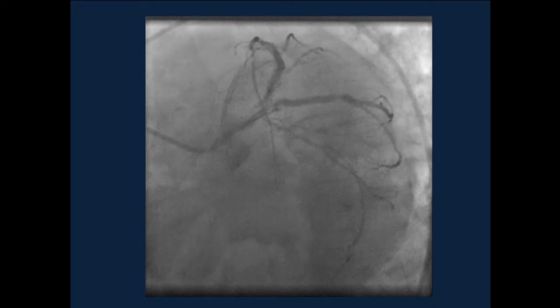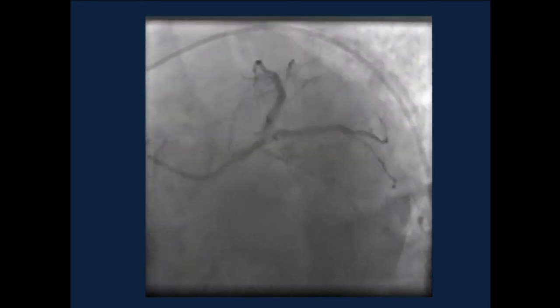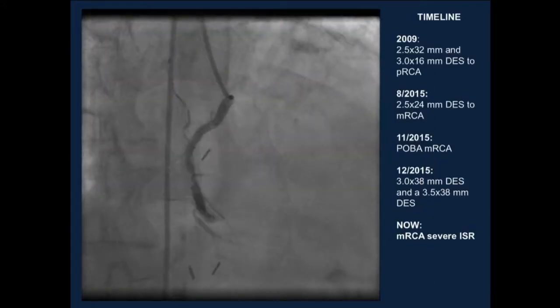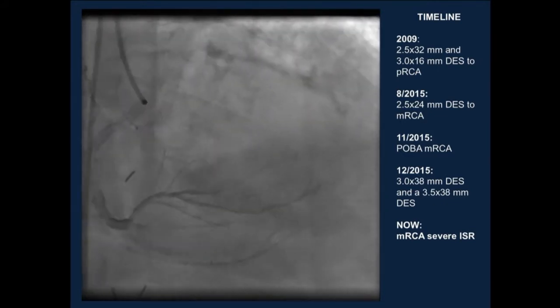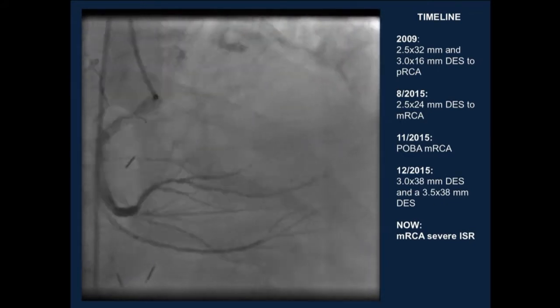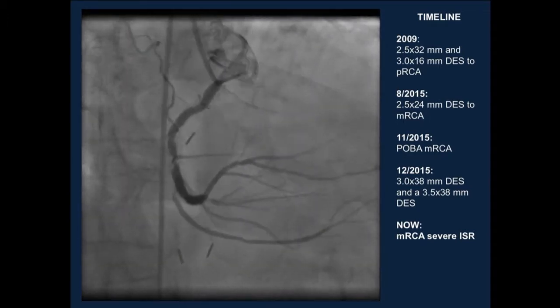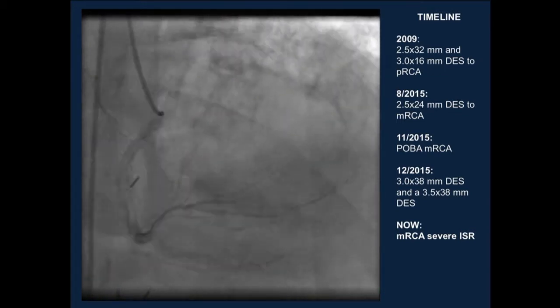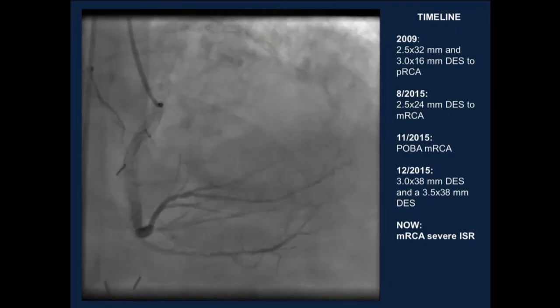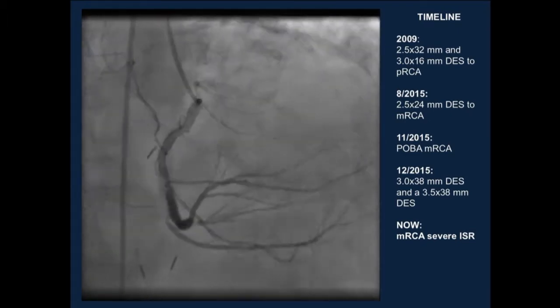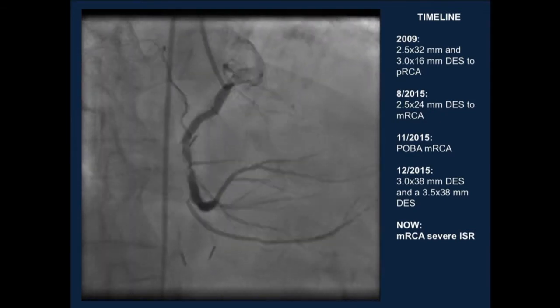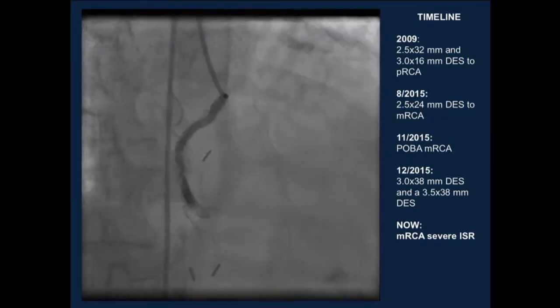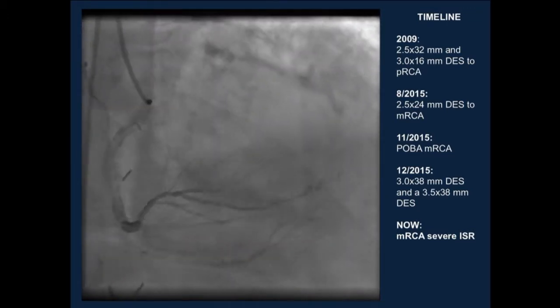Here are the pictures for the left system. As you can see, there is essentially severe proximal ostial LAD, ramus, circumflex, and some distal left main disease. There's the right coronary artery with a number of layers of stents dating back to 2009, when he had a drug-eluting stent to the proximal RCA, subsequently 2015 stents to the mid-RCA, episodes of ISR with balloon angioplasty, and the last intervention in December 2015 with 3.0 and 3.5 drug-eluting stents.